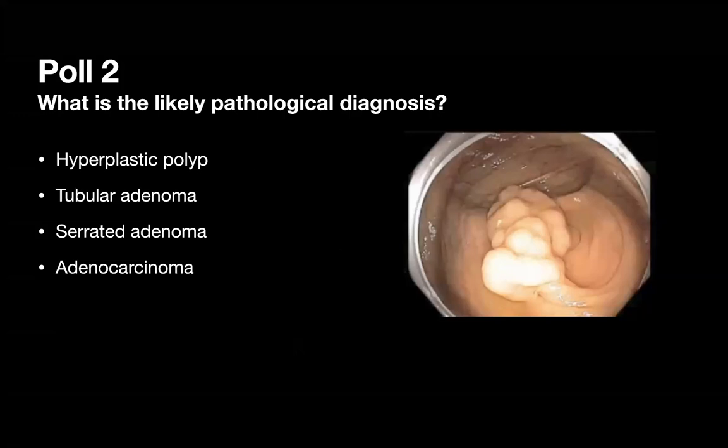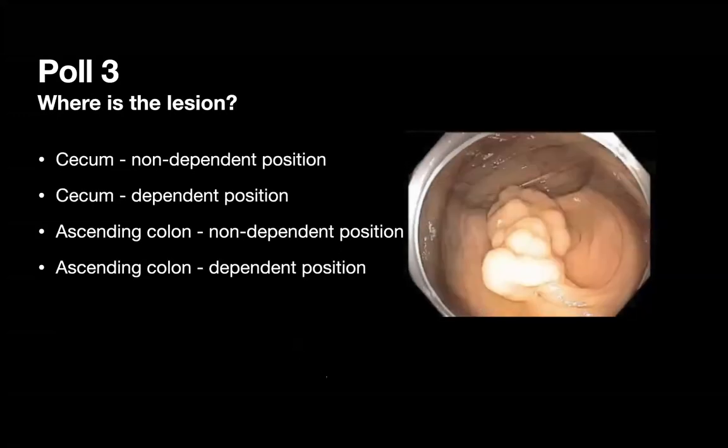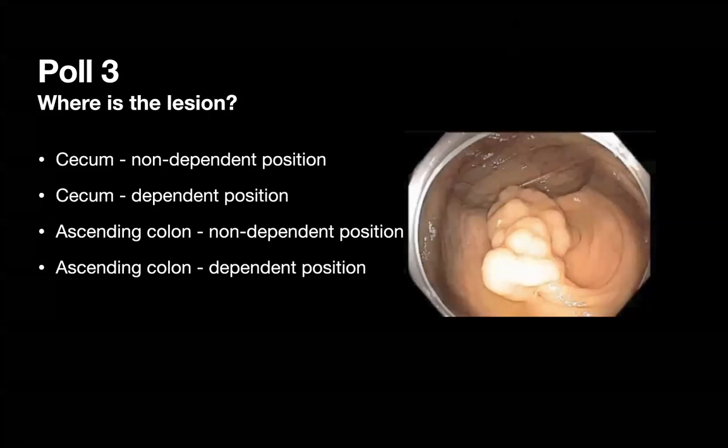Okay. Right. So let's go to the next one. Where is the lesion? Is it in the cecum in a non-dependent position? Is it in the cecum in a dependent position? Is it in the ascending colon, non-dependent position? Or ascending colon, dependent position?